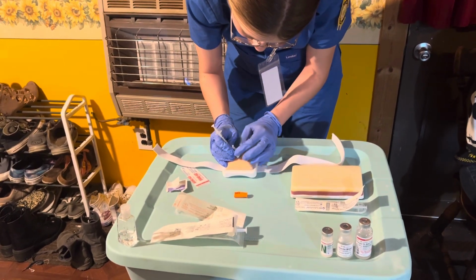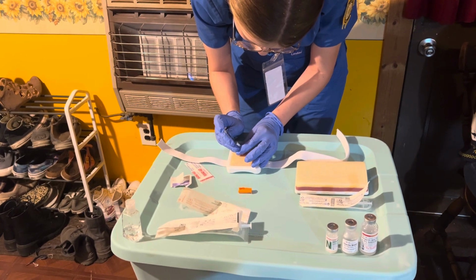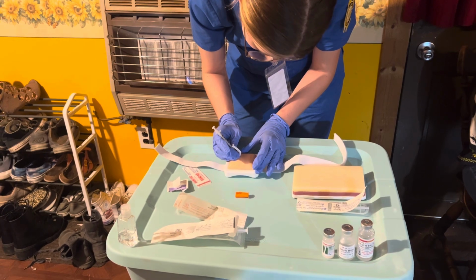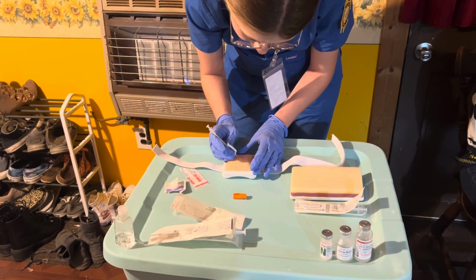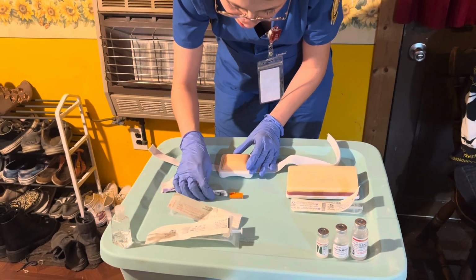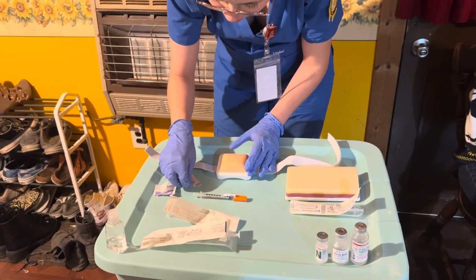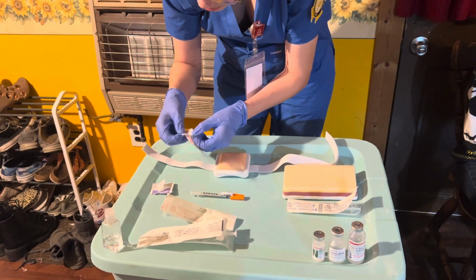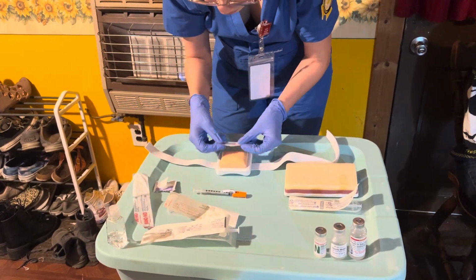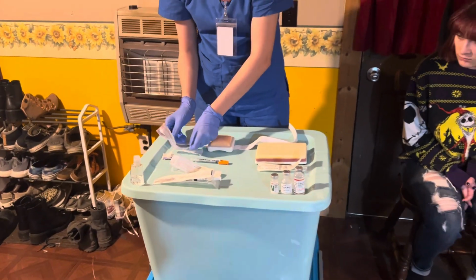I'm going to insert it, hold it with my non-dominant hand, slowly administer the medication, and then I'm going to withdraw the needle at the same angle I put it in at. I would engage my safety, dispose of it in the proper sharp container, but for educational purposes, I'm going to recap it. And then you would take a Band-Aid and put it over the site. Alright.